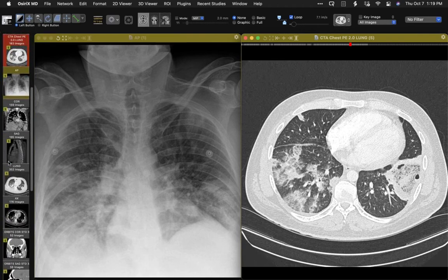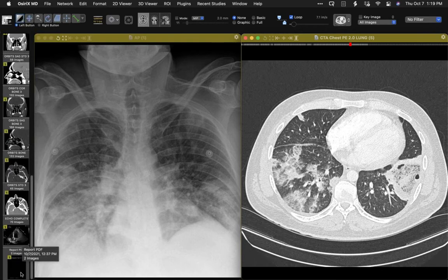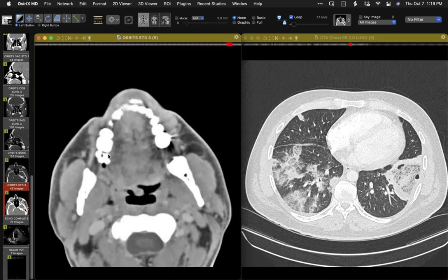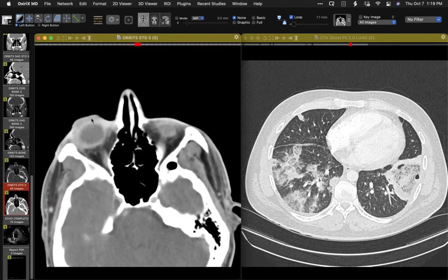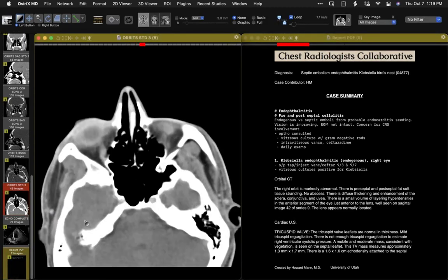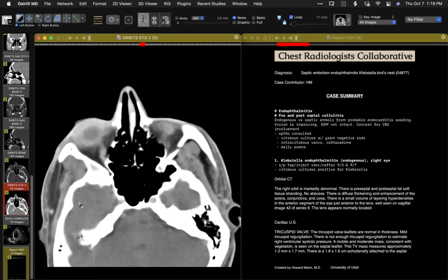In this patient, this is a consequence of an infection with Klebsiella. I say that because the patient presented with endophthalmitis clinically. And if we look at the globes, we can see there's abnormality here on the right side. Here I'm going to put the description of the orbital CT alongside it. There were findings on this, as well as, of course, on direct observation of endophthalmitis. And the vitreous material that was aspirated grew out Klebsiella.